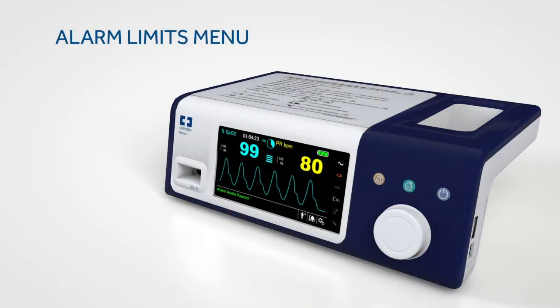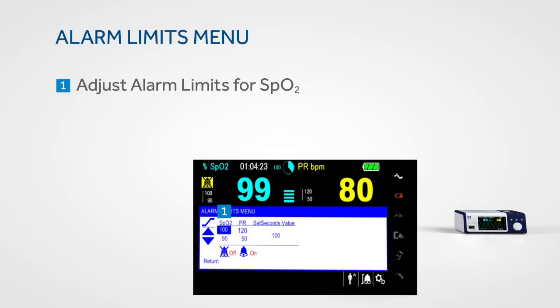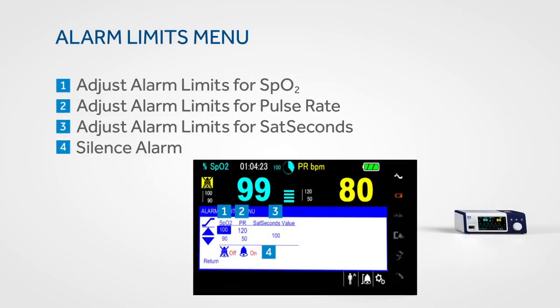To access the alarm limits menu for SpO2, pulse rate, and sat seconds, rotate the jog dial to highlight the alarm limits display area and press. The sat seconds alarm menu allows you to adjust settings to minimise clinically insignificant alarms that occur with your patient.